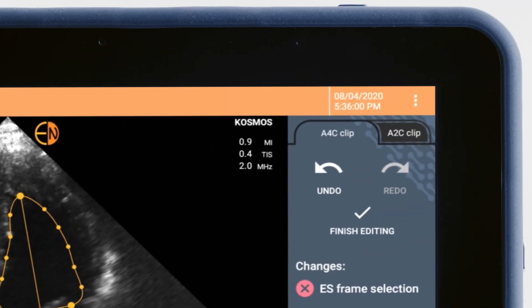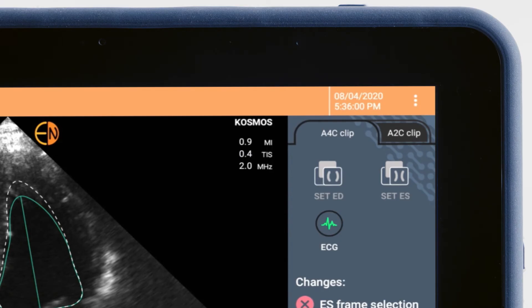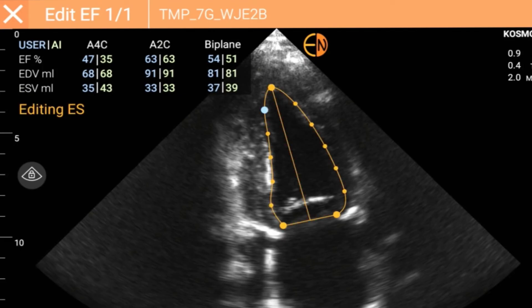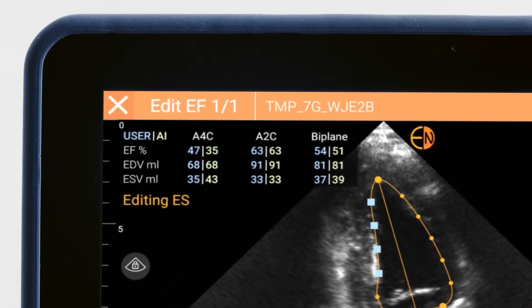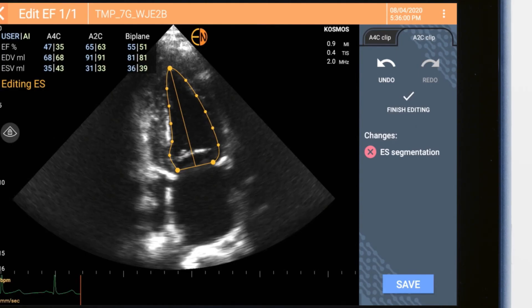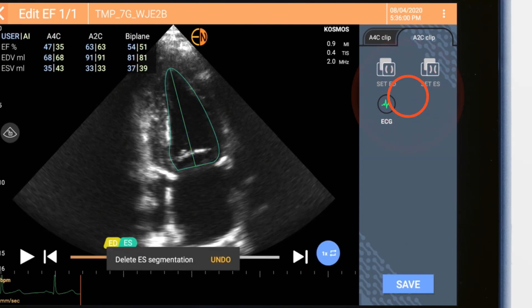To adjust the other frames, tap the corresponding tab to view either the A4C clip or the A2C clip. You may also select multiple dots at once. As you make the adjustments, the values change in the top left and compare the AI-calculated values with the user-adjusted values. To undo any adjustments, simply tap the X next to any change. Save at any time by tapping Finish Editing.